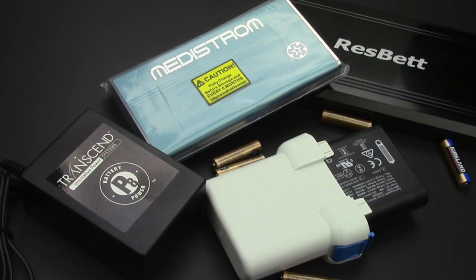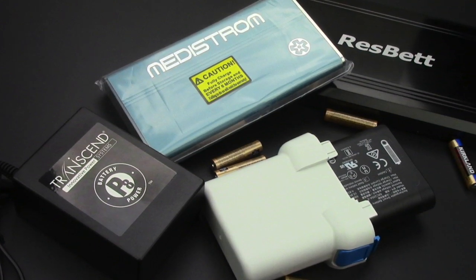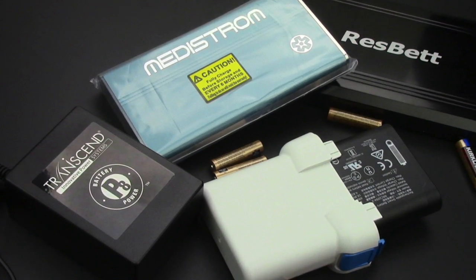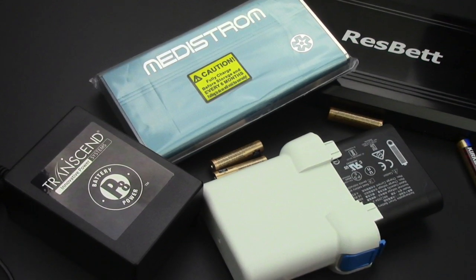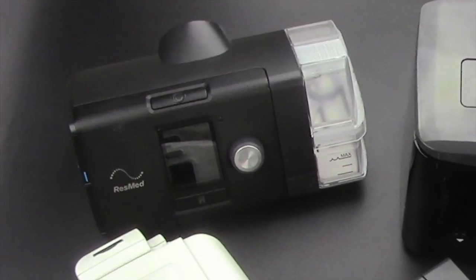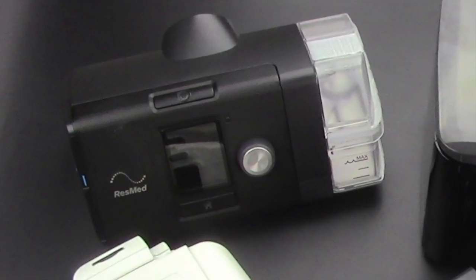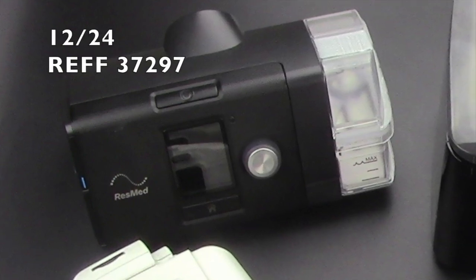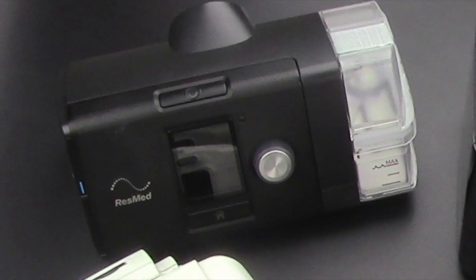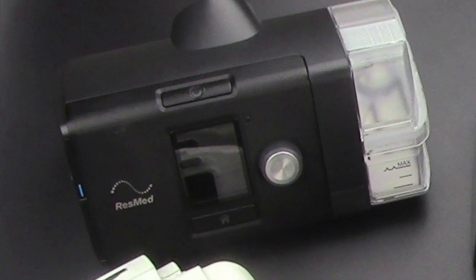So a lot of them will offer a standard straight cord that'll plug into the machine directly into the DC outlet. That is one thing to consider, whether or not your machine is 12 volt or 24 volt. If you do have a 24 volt machine, an example being all ResMed CPAP machines are 24 volt, you will need a 12 to 24 volt converter. Those tend to be a little bit more bulky and a little bit more expensive, but that would be the only option if you want to plug in to a cigarette outlet.